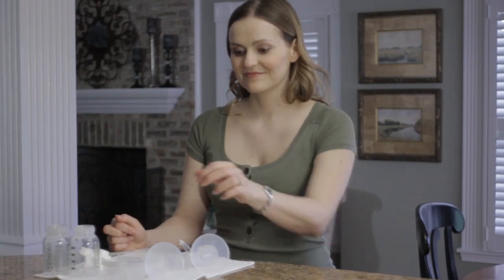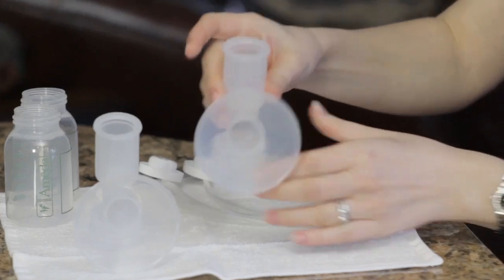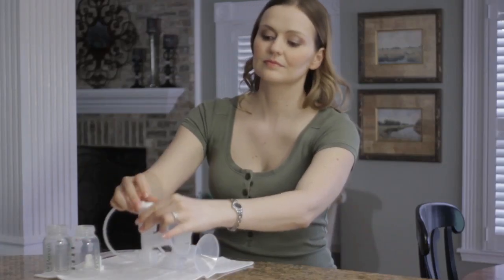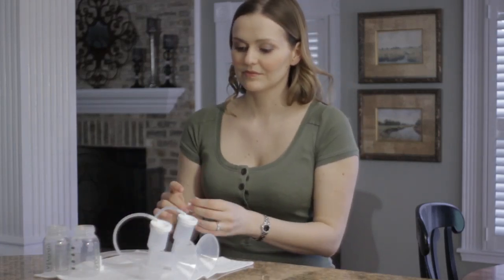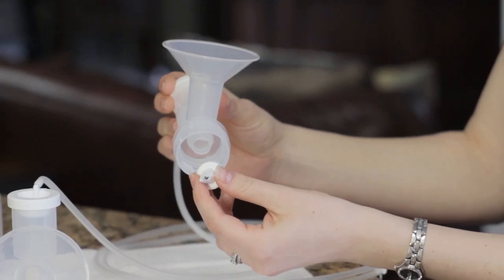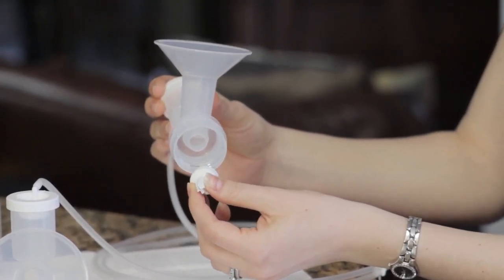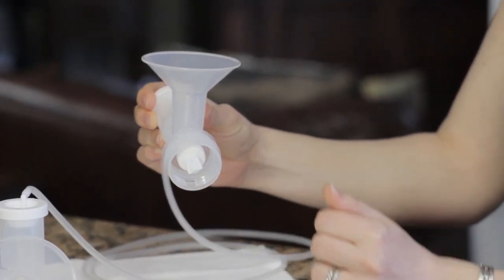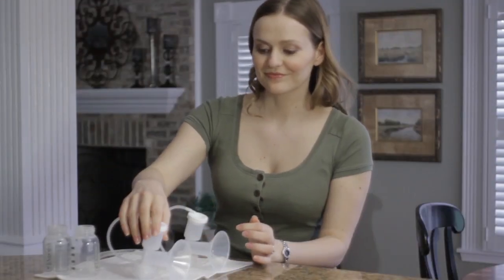To assemble the Hygiena Kit, first insert the diaphragm into the upper chamber of the breast flange. Then snap the adapter cap, with the tubing attached, onto the top of the upper chamber. Next, hold the white valve carefully by the thick sides, not the flat edge. The valve will compress slightly. Gently push the white valve firmly onto the ring on the underside of the breast flange. The white valve is vital for proper suction and should always be handled very gently.